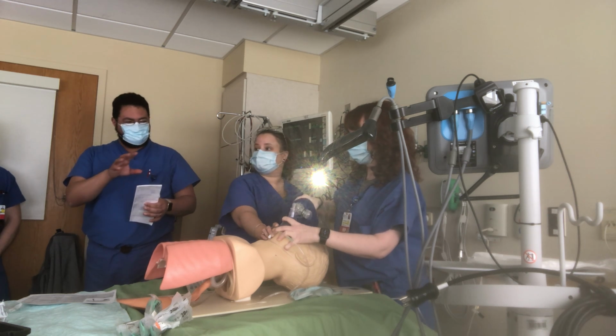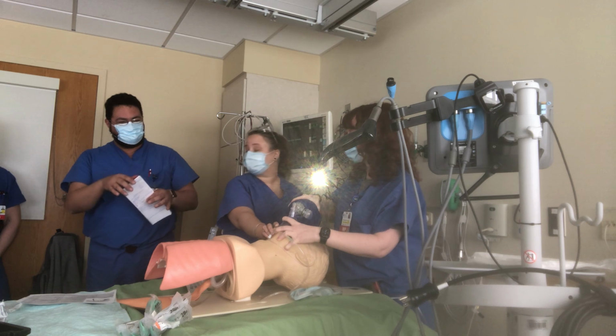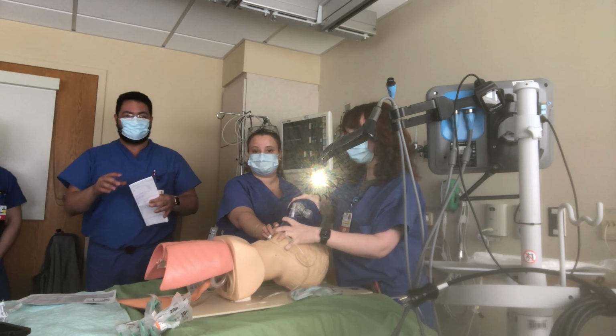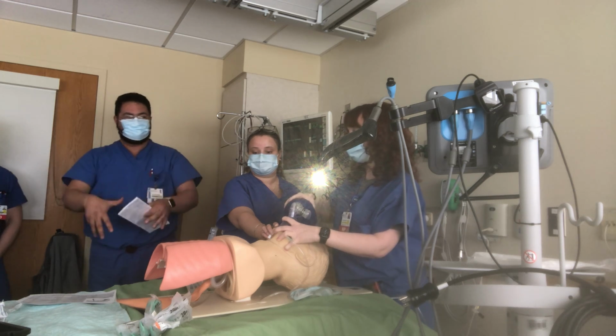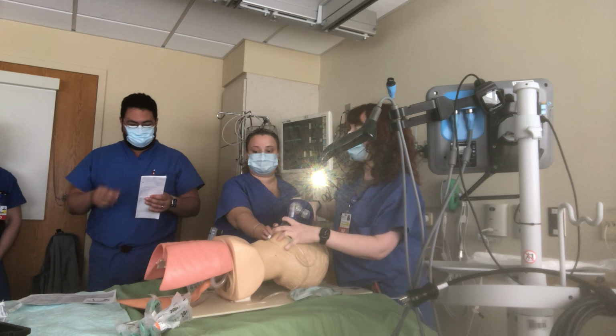This one counts. If it's difficult ventilation like this, and you get it with multiple people, then you use a glidoscope. We'll go back to the glidoscope. But let's say we couldn't. 8 people holding the patient, and we couldn't ventilate the patient. We still can't. So what are we gonna do?